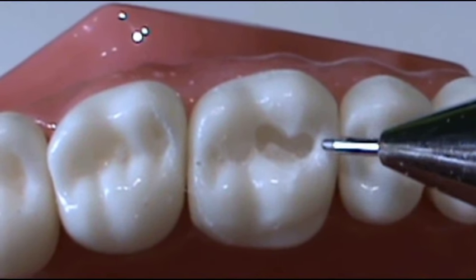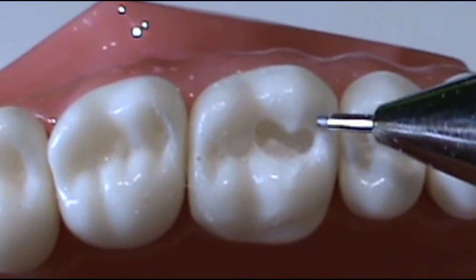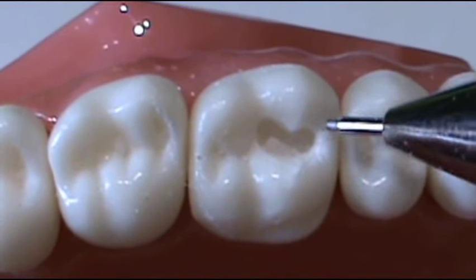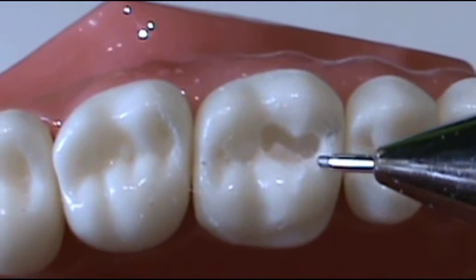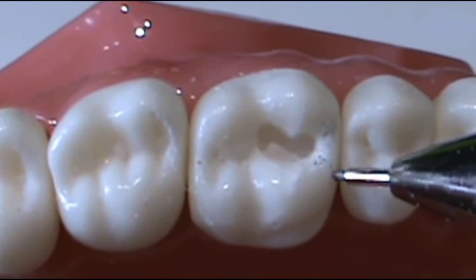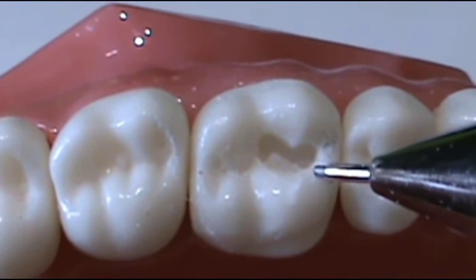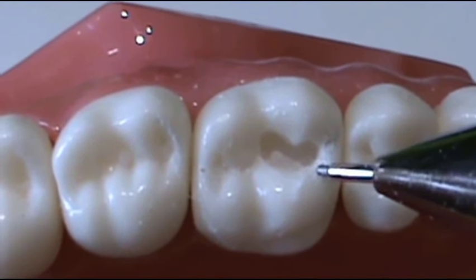After completion of the Class 1 cavity, this area of the tooth structure should be removed.